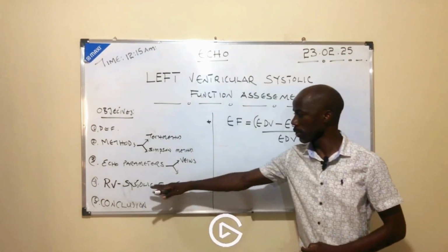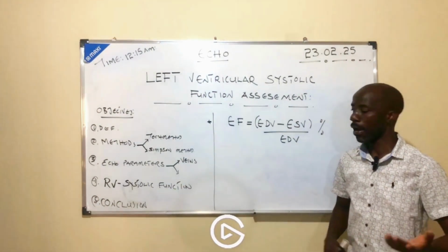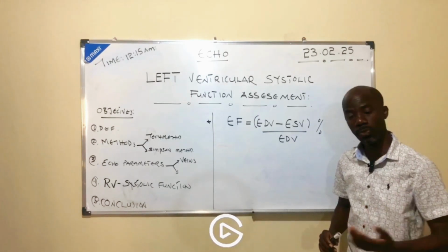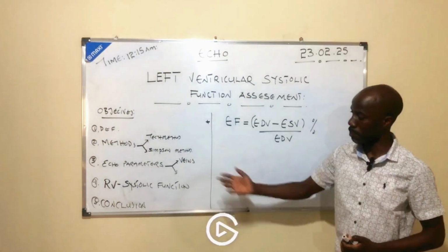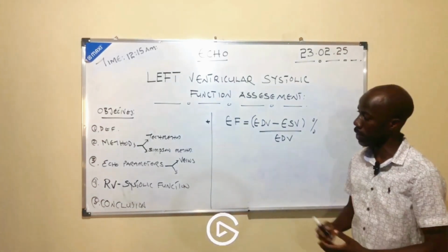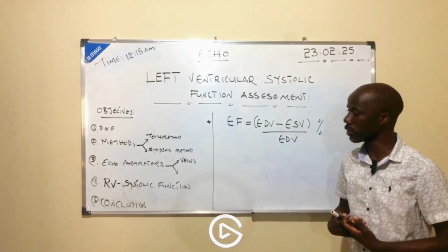I'm also going to look at the right ventricle systolic function. This is another part where sometimes we forget to discuss about the systolic function of the left ventricles. But typically, we also have to take into consideration that the ventricular function of the heart also takes into consideration the right ventricle systolic function.